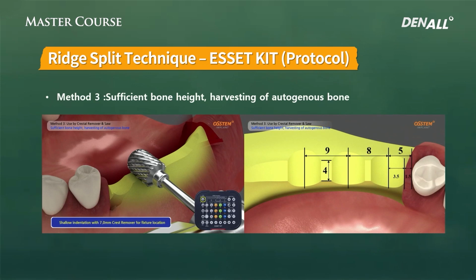However, there can be interference with the patient's tongue and buccal flap. Therefore, it's not recommended. The recommendation is to do the first option, where 4 mm of ridge width is secured in the implant placement sites. That'll be more favorable.